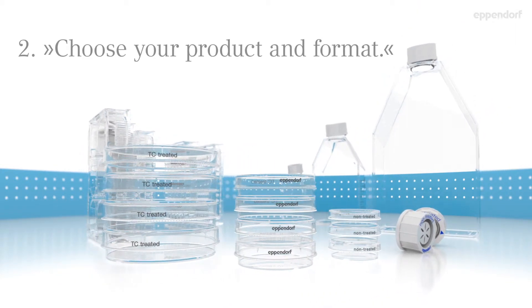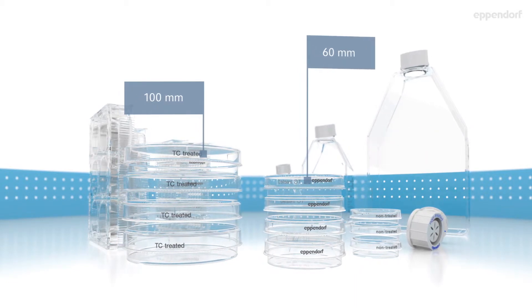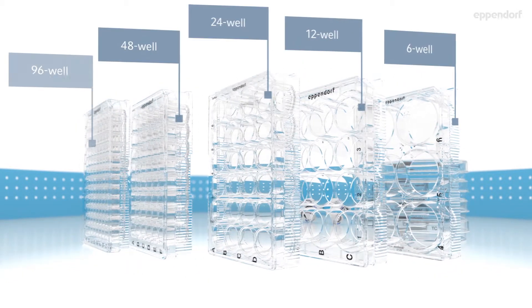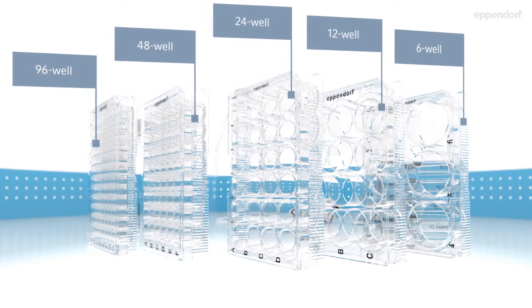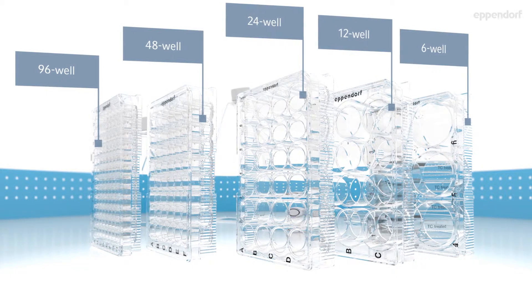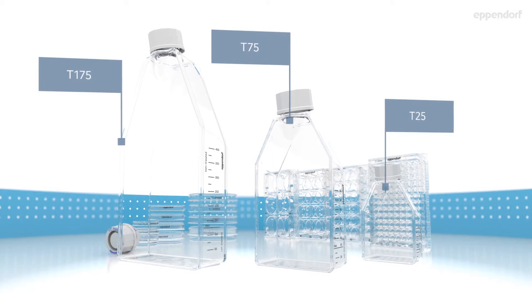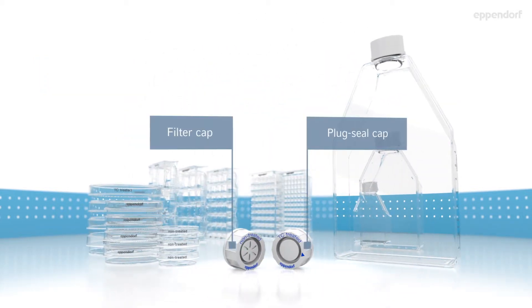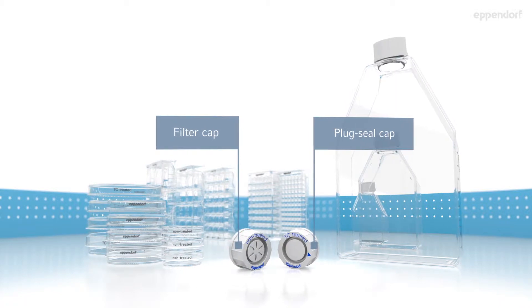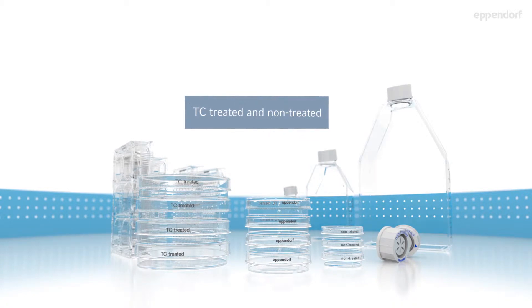Choose your product and format. Eppendorf offers three kinds of dishes, five different plates, and three types of flasks. Flasks are fitted with filter or plug seal caps. All products are available with two surfaces: TC treated and non-treated.